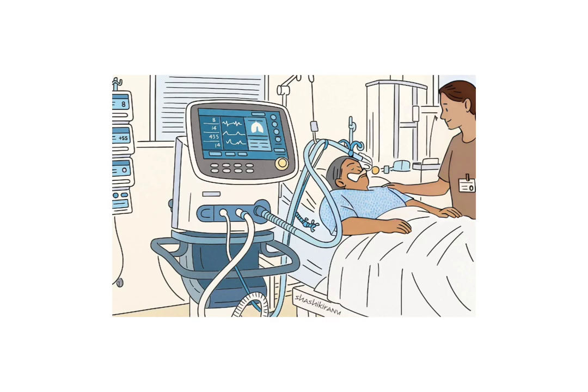Now that we understand what a ventilator is, let's move on to the next part. We are now going to discuss the purpose of mechanical ventilation. Ventilators are used in critical care to support or completely replace a patient's breathing, especially when they're unable to breathe effectively on their own. Here are the most common clinical situations where ventilators are used. Mechanical ventilation is commonly used in the ICU, in emergency situations, or during surgery under anesthesia. It's essential for patients with respiratory failure, head injuries, spinal cord trauma, or neuromuscular disorders like Guillain-Barré syndrome or myasthenia gravis.